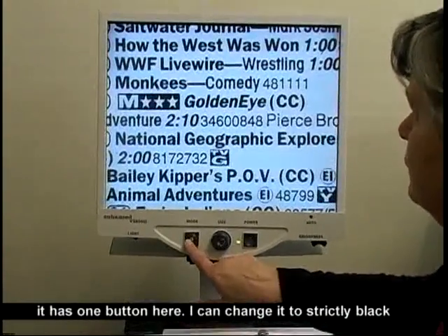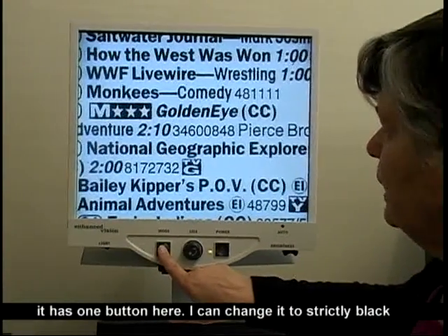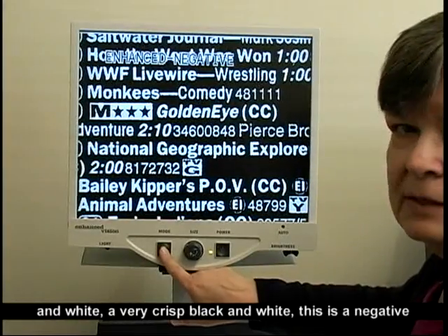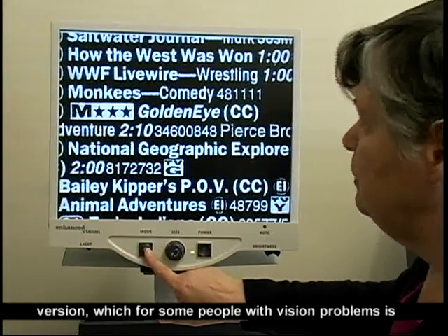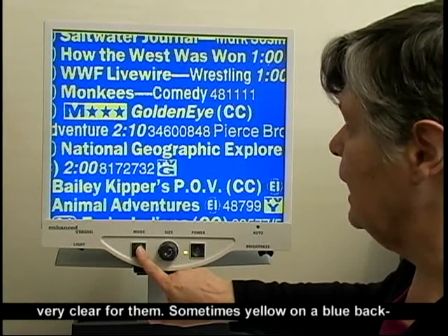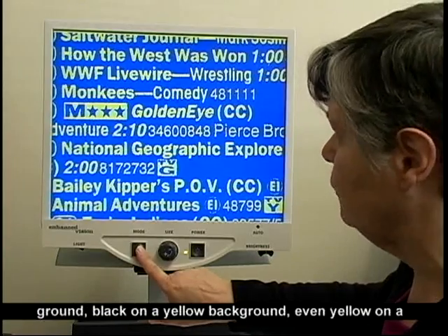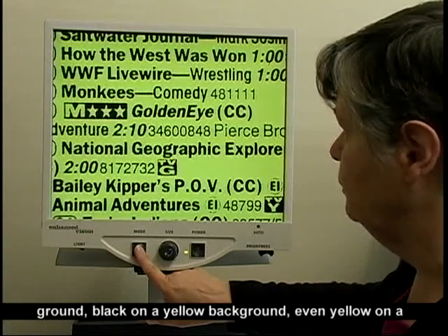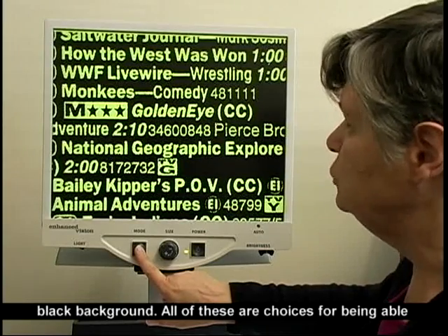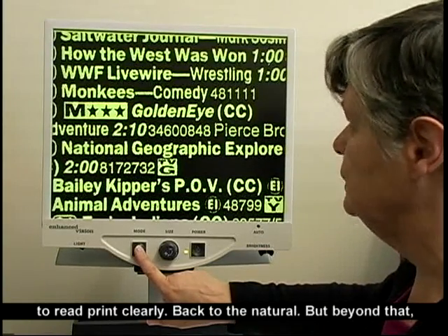It has one button here. I can change it to strictly black and white — a very crisp black and white. This is a negative version, which for some people with vision problems is very clear for them. Sometimes yellow on a blue background, black on a yellow background, even yellow on a black background. All of these are choices for being able to read print clearly.